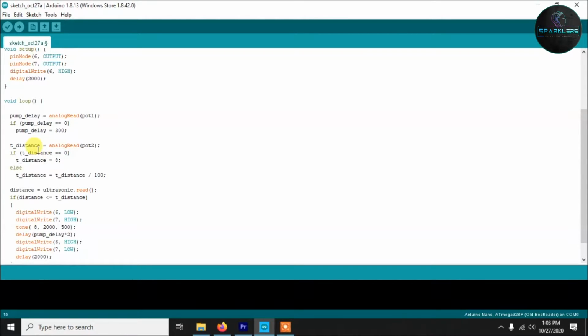Same for the t distance. T distance stands for threshold distance. It is to set the distance between your hand and the sensor. Now here we are also reading the value, and again if the t distance is 0, in that case we will set it to 8. Now here 8 stands for 8 cm. I mean, in future when we use it, it will stand for cm. So if you have set that potentiometer to 0, the default value will be 8 cm.